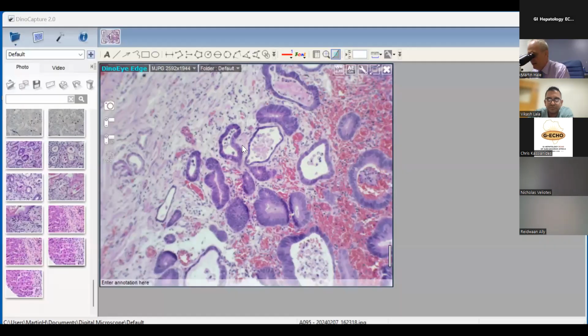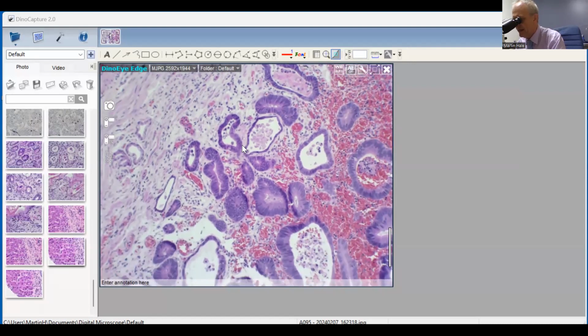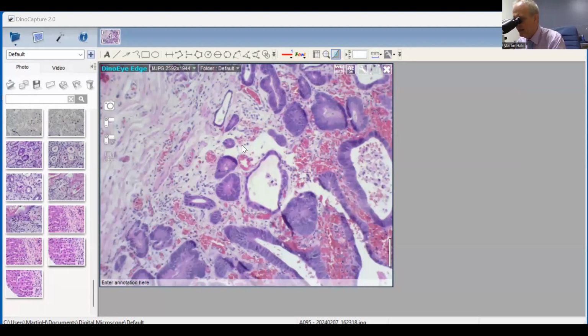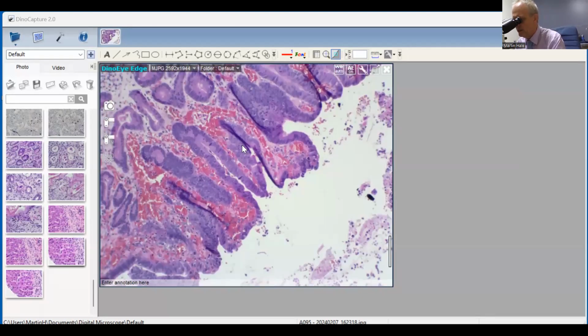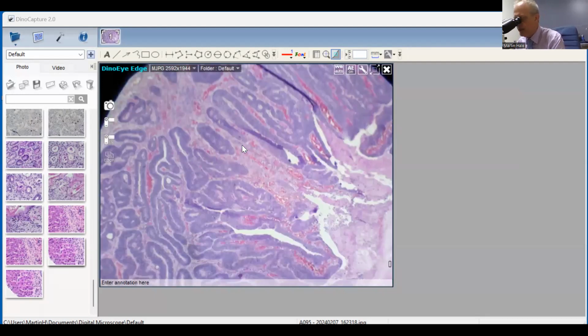So I've just picked up this area here. And we could spend hours poring over these things, deciding whether they are invasive or not. It's almost like saying, ask 10 different pathologists to get 10 different answers. So here, for example, I think it is fairly straightforward to say that by virtue of its mass effect, it is an infiltrating tumor.